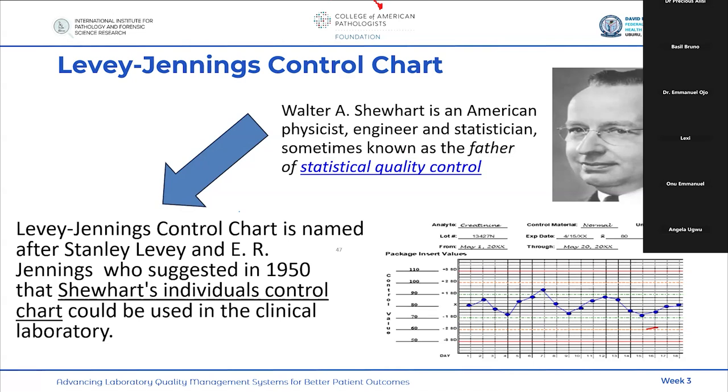So that's that about your second question. The first question about proficiency testing, I didn't remember saying that you have to score 100%. And that is actually not the way this is being evaluated. So the process is that whether you are using a consensus method or a reference method for evaluation, that's the PT provider now.